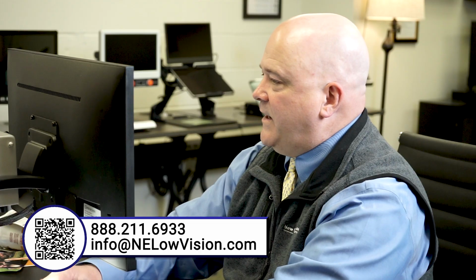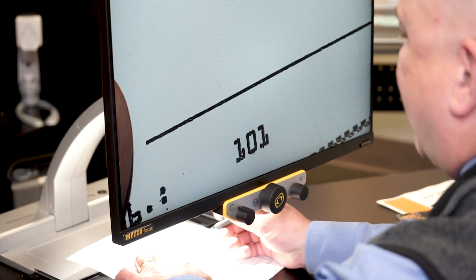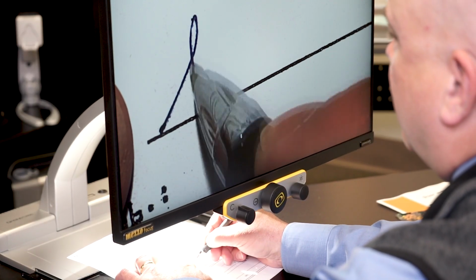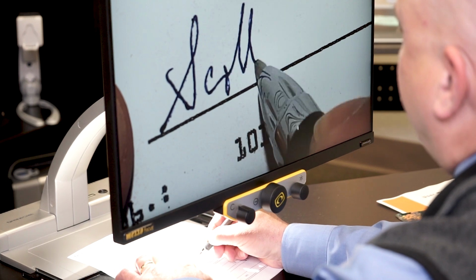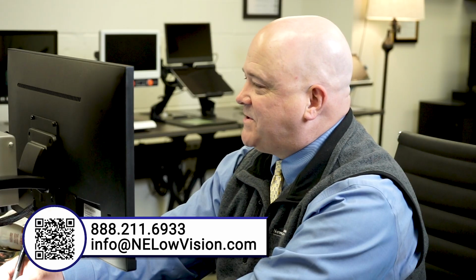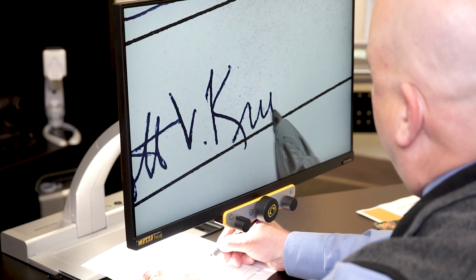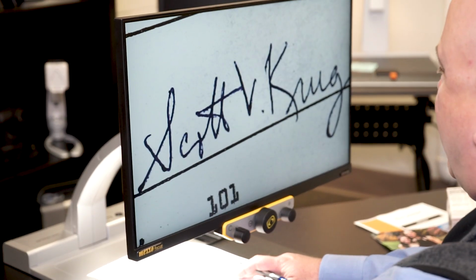$78.26. And now I have to go sign my name at the bottom here. I'll find my spot, keeping my eyes on screen, and there I sign my name. I'm running out of room, so I can't keep signing. So I have to move it over some more and have the space to write. And now I can see it on screen.